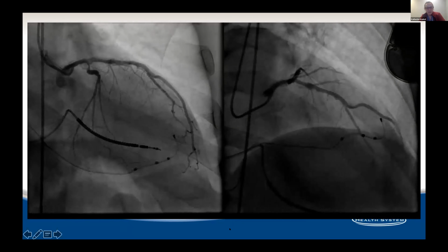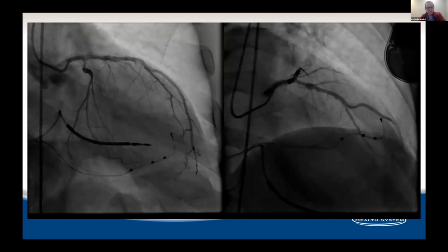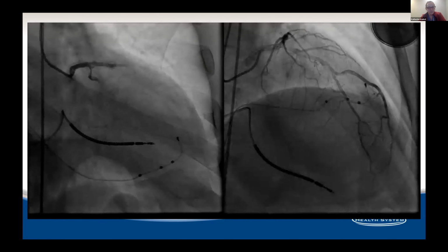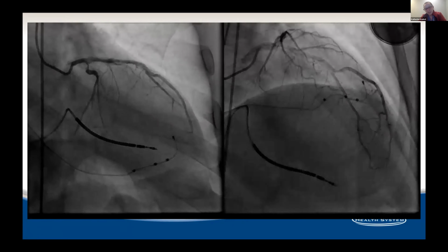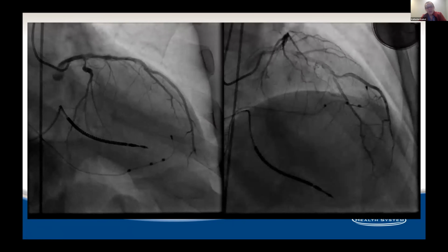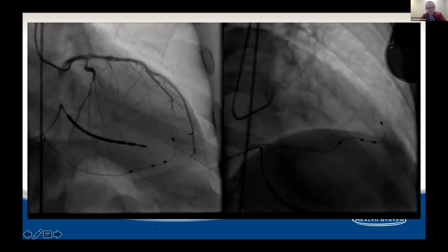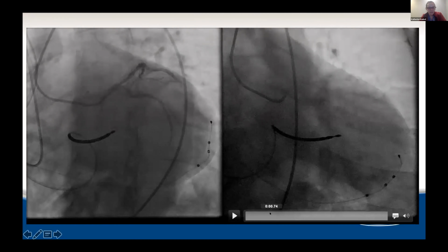Initially we're obviously seeing a lot of proximal calcification in the distal left main. In the first angiogram, the thing that's jumping out at you is this proximal circumflex lesion. As we look a little more, you see there's a mid LAD lesion right after that very large diagonal that's again quite calcified, right by that septal. We really don't see the bifurcation of the left main and LAD very well on the initial angiograms.